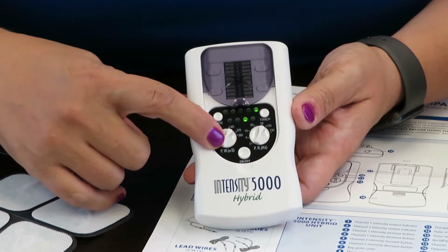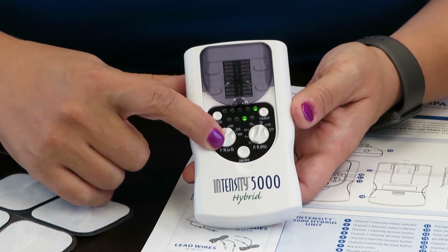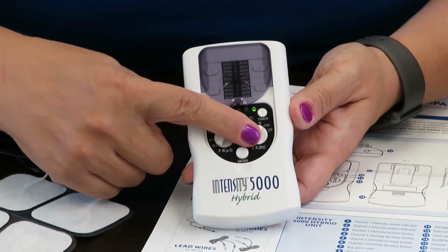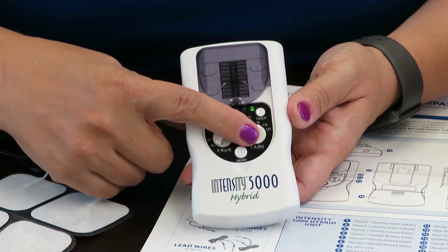Moving the PW knob will decrease or increase the length of the stimulation time between pulses. Moving the PR knob will decrease or increase the length of time between the stimulation phase.